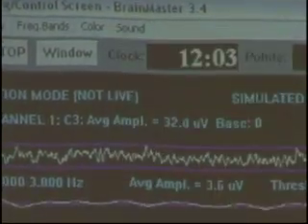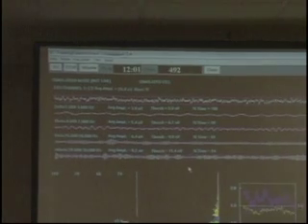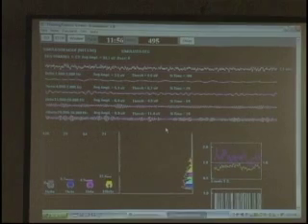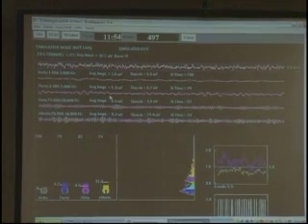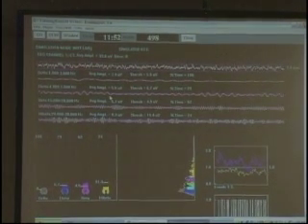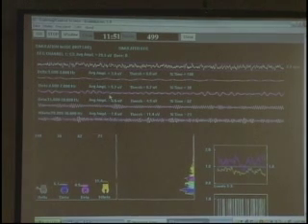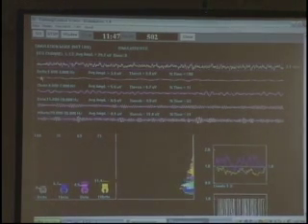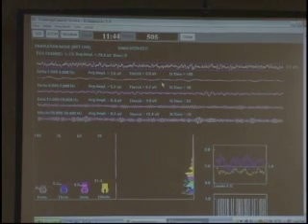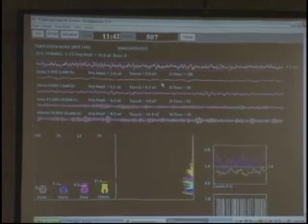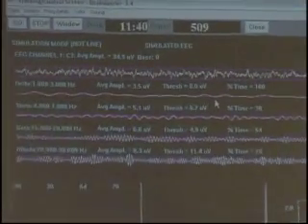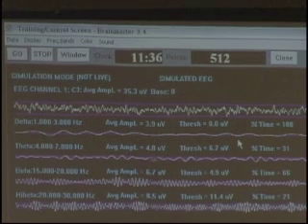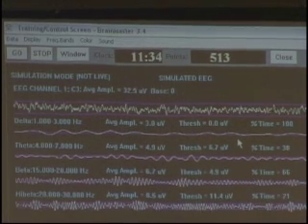The only one that's not coming out of the line is the wrong one. Why is that? Because the lines on the filter represent something different. Look at mine — I have a straight line through Delta. What does that mean? It means ignore it; no feedback is based on it. It's right at the zero line.